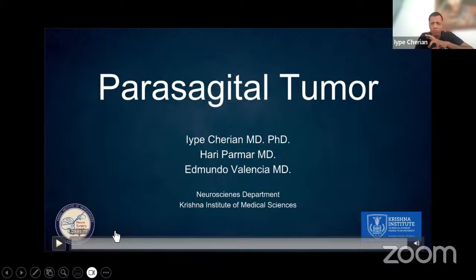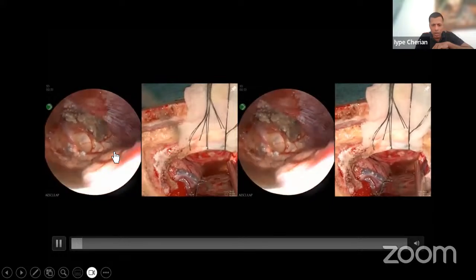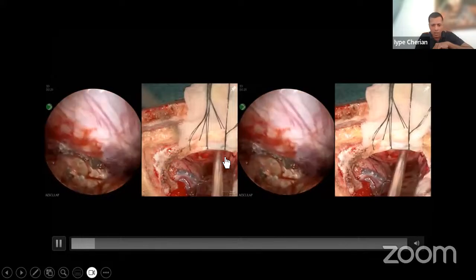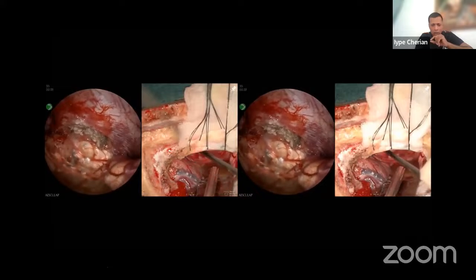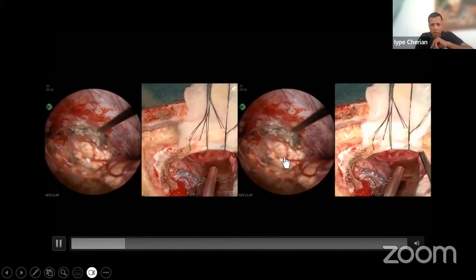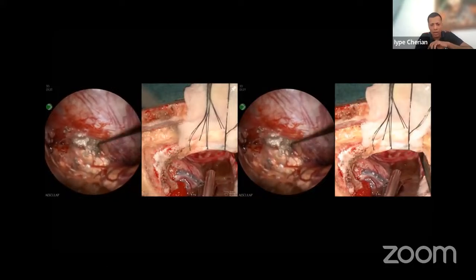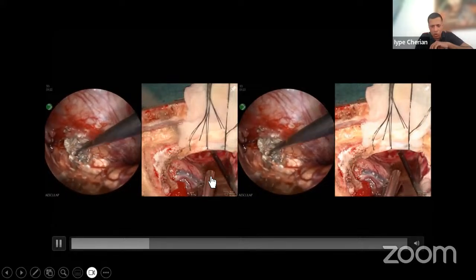talking about exoscopes and endoscopes together, we wanted to show you something more. And this is an exoscope image. And this is a 3D endoscope image. This is a laparoscopic camera. It's a 10 millimeter scope, but it is not good for a transnasal or transventricular endoscopy. But for cranial assist, this is one of the best scopes because the clarity is just, you know, it's 4K. It's really 4K. And you can see on the exoscope, you can see this endoscope there.